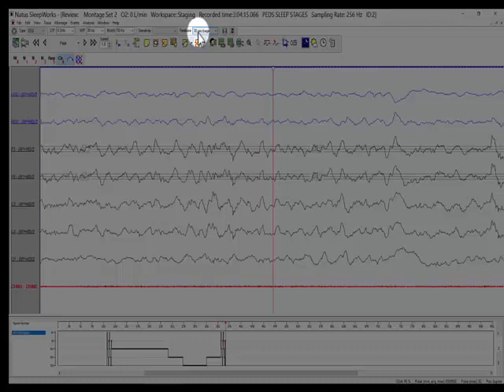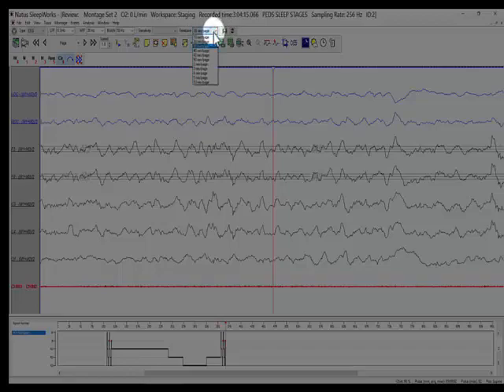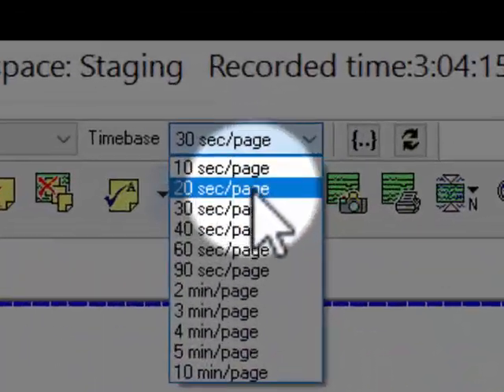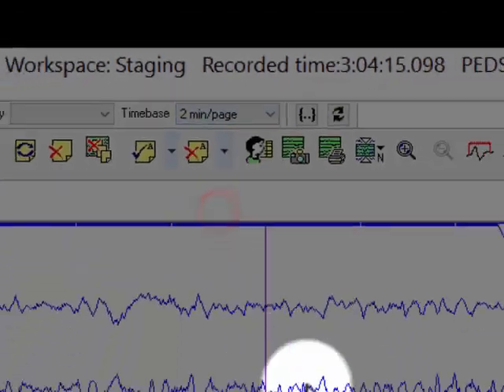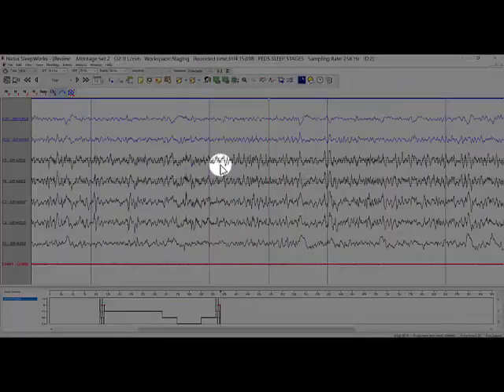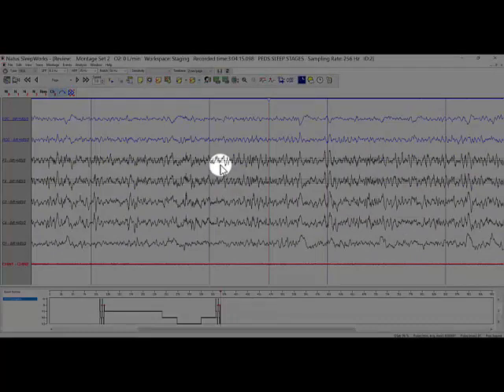However, if your epoch length is 30 seconds and your paper speed is 2 minutes, you will see four epochs per page. And navigating by page and epoch will be quite different.